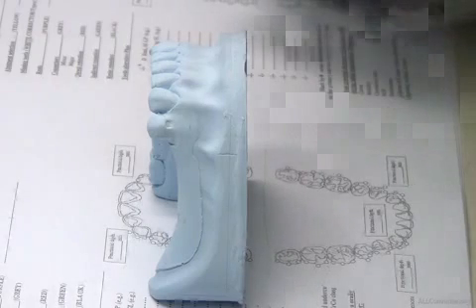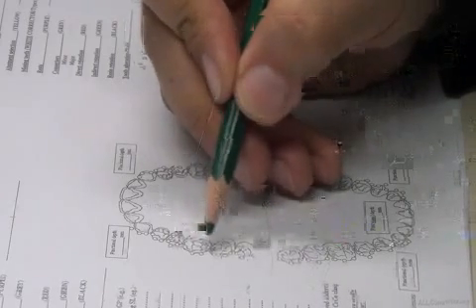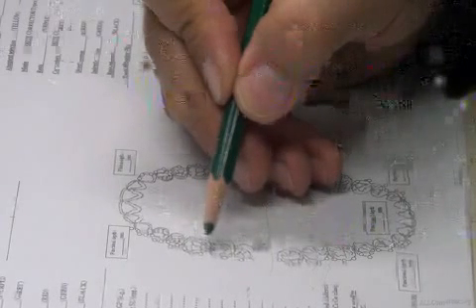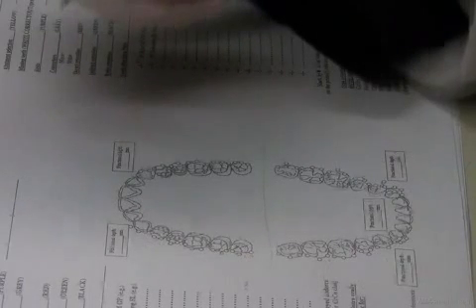Okay? So when I want to fill in, the design form has a way where we have empty circles. Can you see the empty circles around the teeth? These empty circles around the teeth are to tell you where my suitable undercut is. So after surveying, wherever you find your undercut, put a mark on it. You're going to fill in the circle, saying that my suitable undercut is here, on this tooth. This is how to fill the form.